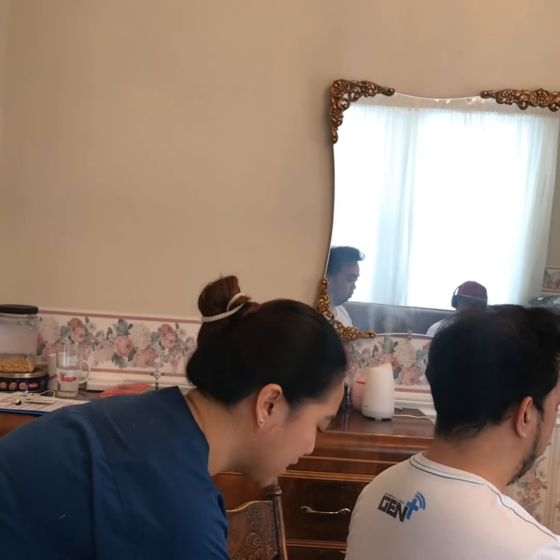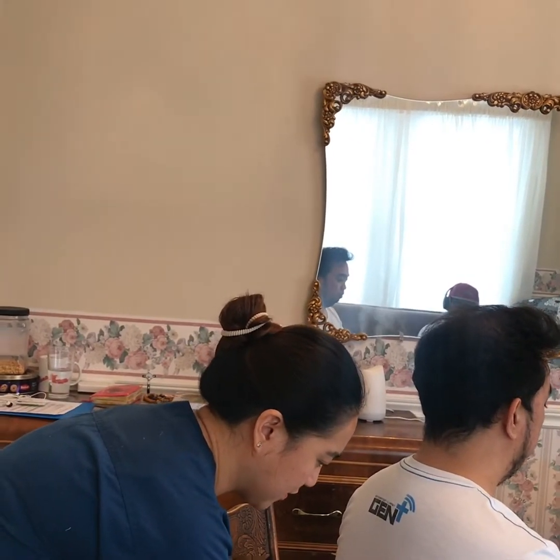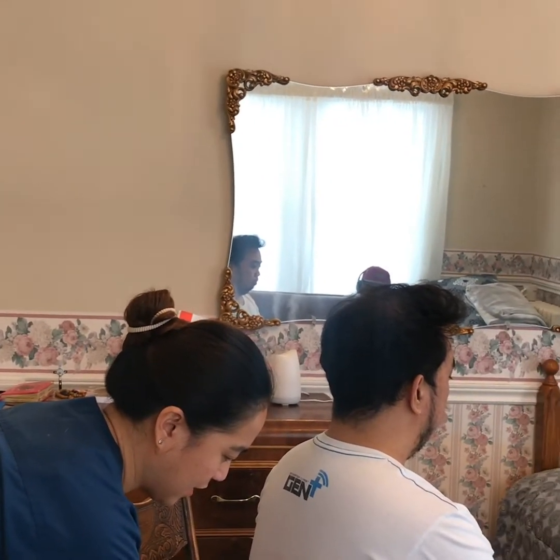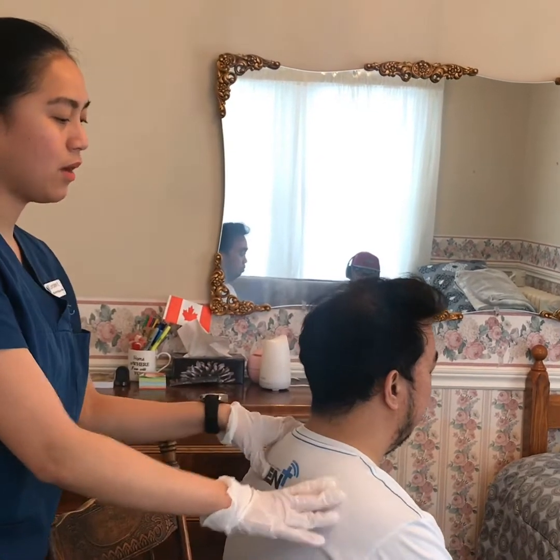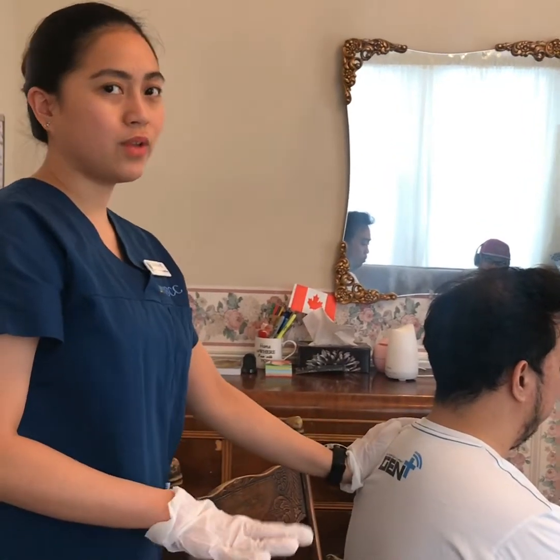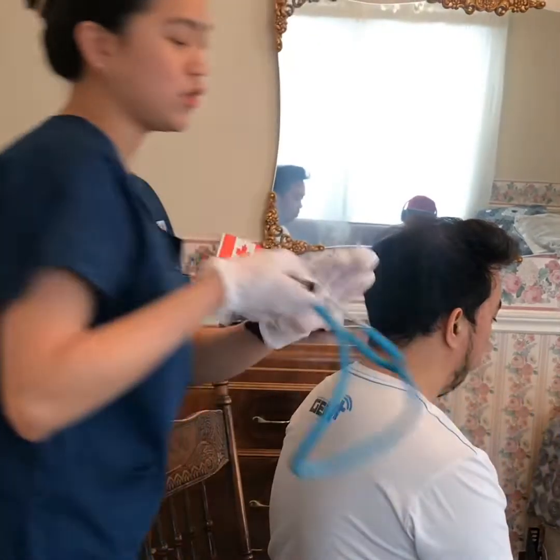So, sir, can you please inhale? Okay. And then exhale. Inhale. And exhale. Okay. As you check his back, you can also check for any abnormalities or adventitious sounds on his back by auscultation.